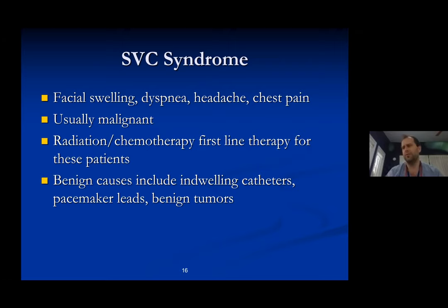And those coils come also in a variety of flavors that, you know, some are more thrombogenic, others are less so. Some can be retrieved, or some can be partially deployed. And if you're not happy with position, you can retrieve them, some can't. So it all depends on what sort of practical circumstances you have at hand.